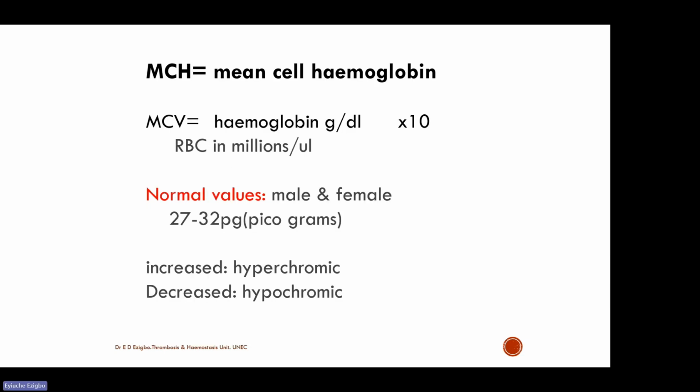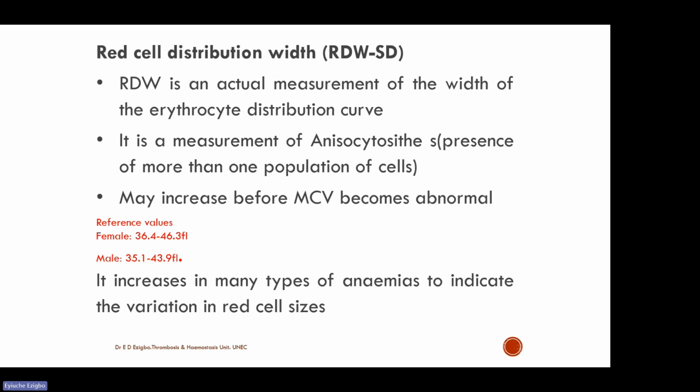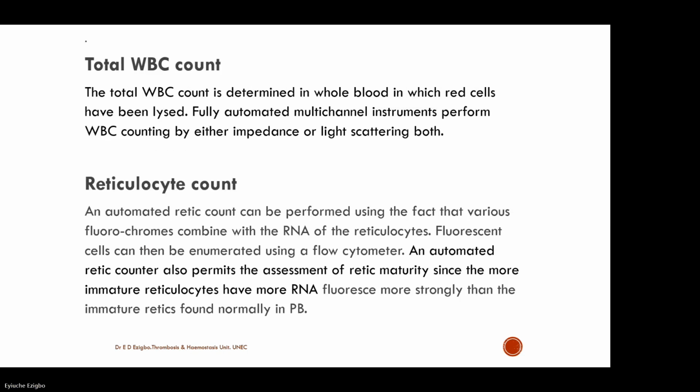Some of the hematological indices and how they are being calculated. I won't waste time here. When you look at it, you'll be able to know the formula. Okay, I won't go there. We've discussed the white blood cell counts in detail.